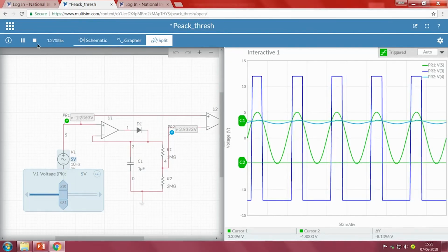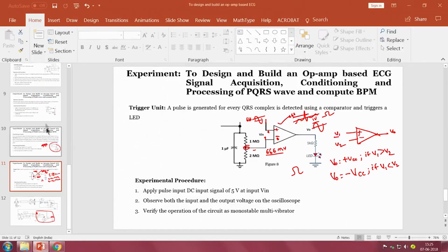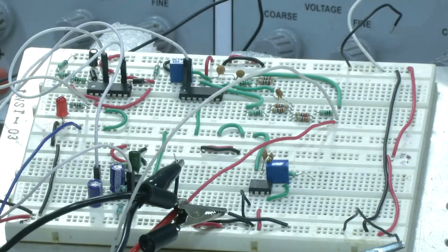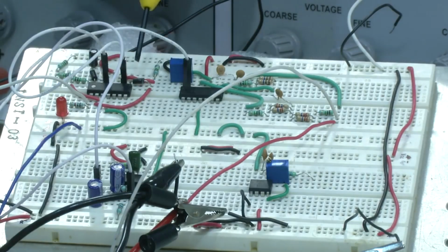Now we will see experimentally, right, we will see experimentally the complete circuit. Now if you see the next part of this particular portion, we are using a diode, right, and we are also using a resistor, right.